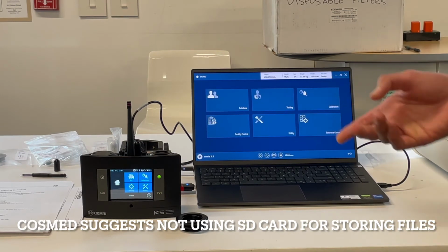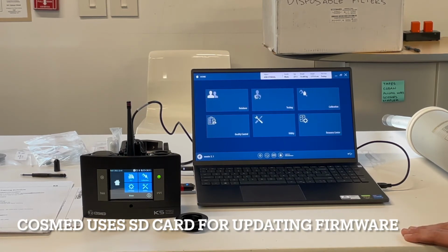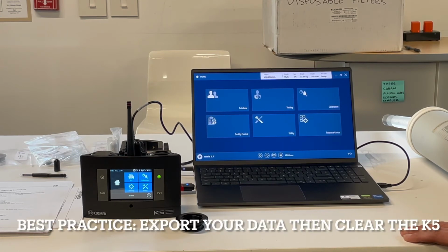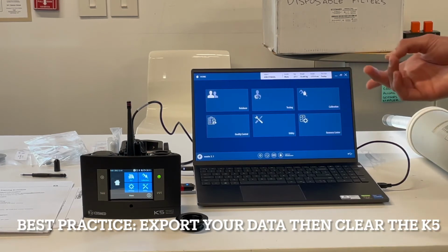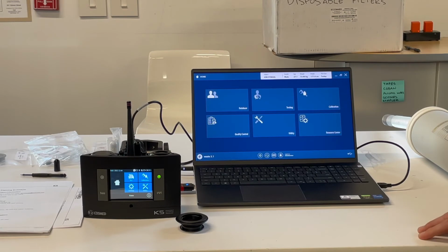We use the SD card to update the firmware. That's how we update that unit. Even though you can save data to SD cards like that, we have run into those issues before, and it's a firmware thing that hasn't really been addressed, I don't think. Okay. The information I've gathered from engineers is to tell people to do the data export and erase everything that way after each use, because we've had issues with the SD card. Yeah, because once I started clearing it after each use, it's been fine. It seemed to be some number of files, and it's not near the size limit or anything.